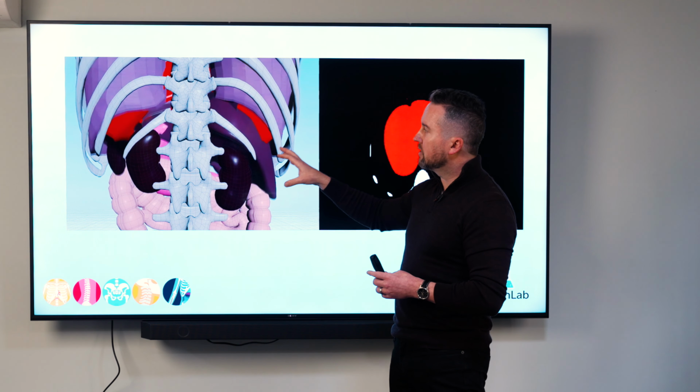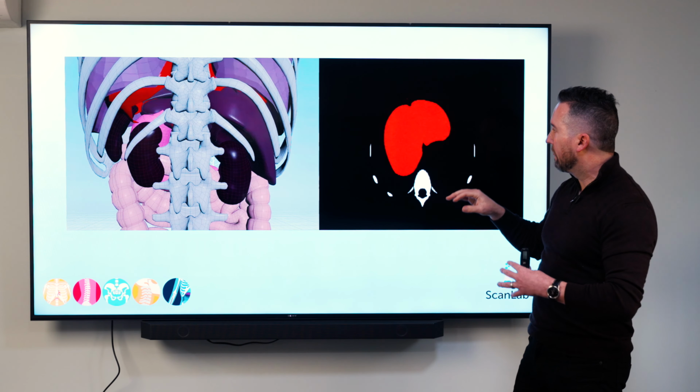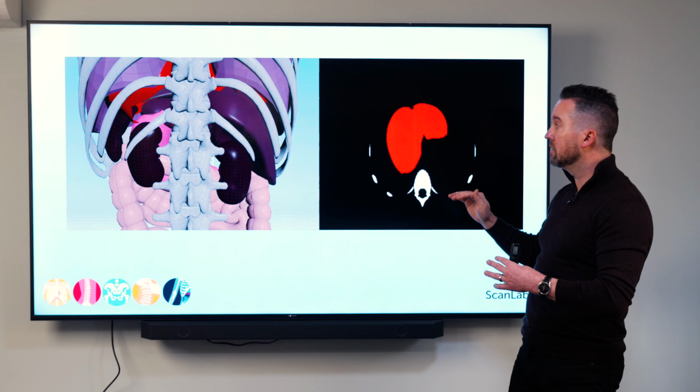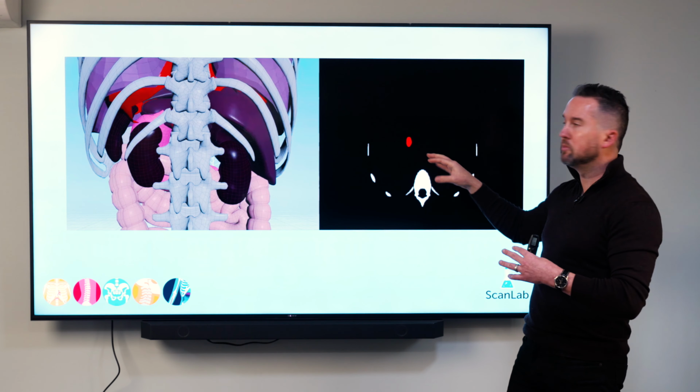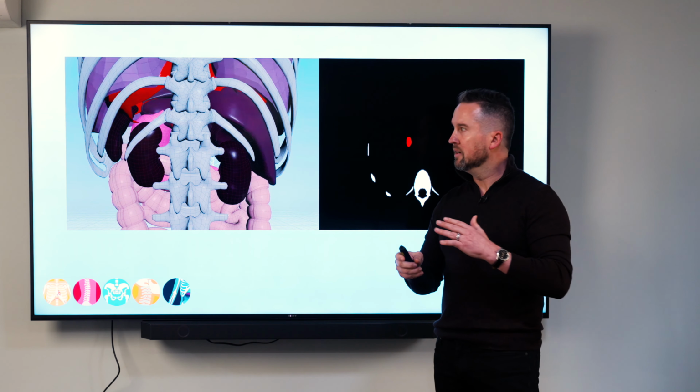Then there was another problem: what we had to do then is start to map the way that the human body not only moves when I breathe, but also in the Z direction, and started to see how big, deep breaths actually displace, in this case, the liver. This has been something we've been working on for at least 2 months, because this liver, it's not that simple. The liver is moving up and down, but it contains the blood vessels as well. So how are we able to track the amount of contrast and dye that is coming through a moving vessel? And all of this has made me realize just how special the human body is as a whole, and trying to replicate it takes so much work.